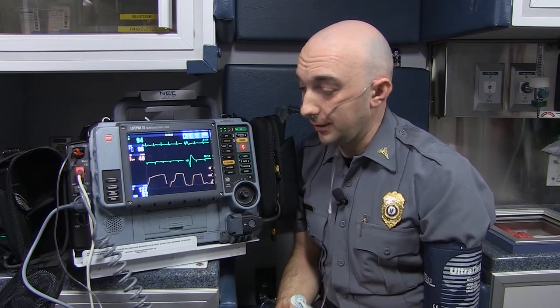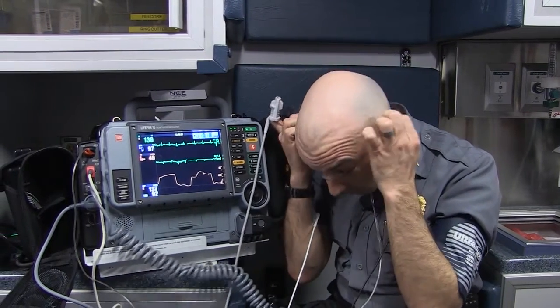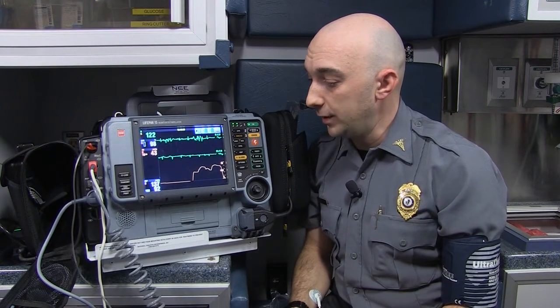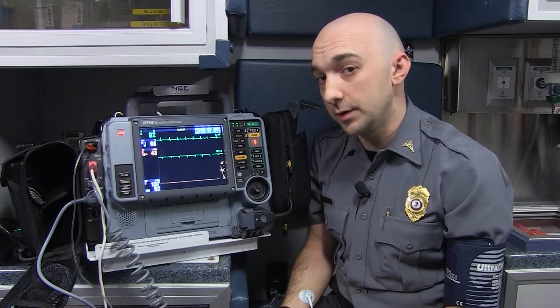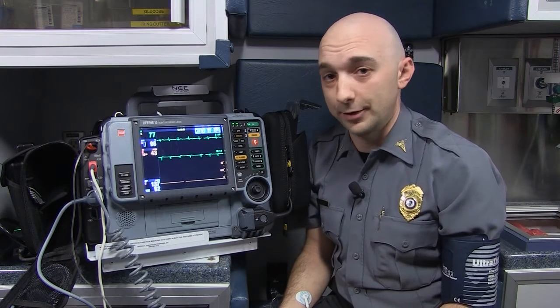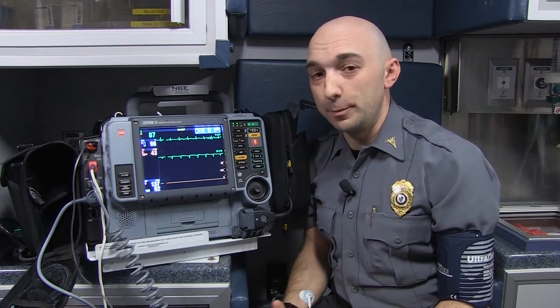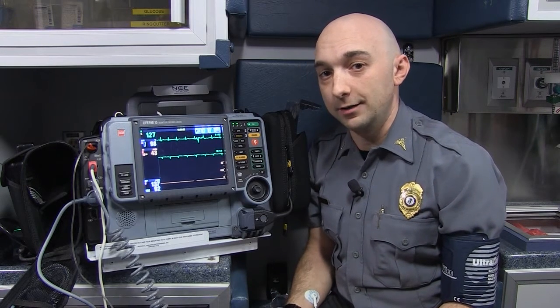This is all of our assessment on one person, working together. What this machine also allows us to do is not only assess a patient but also treat them. I'll take this off so I don't hyperventilate. Once we assess a patient and look at their heart rate, if we see a certain type of heart condition — something paramedics are trained to interpret — the indication for treatment is sometimes to actually shock their heart, just like an AED, an automatic external defibrillator. But this is completely manual — there's nothing automatic about it, because paramedics are trained to treat.